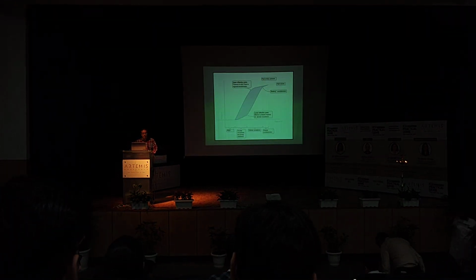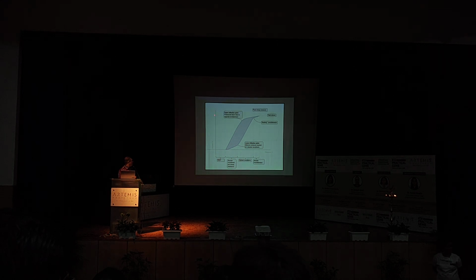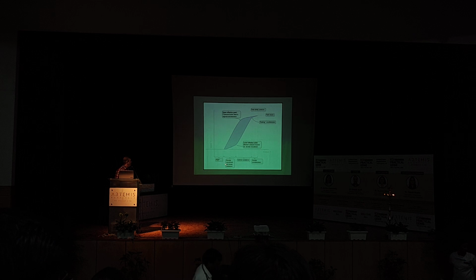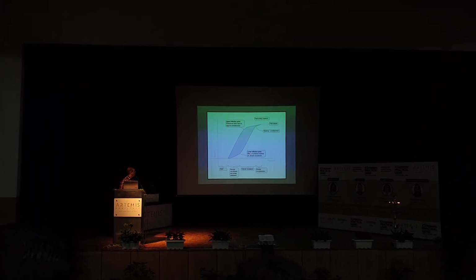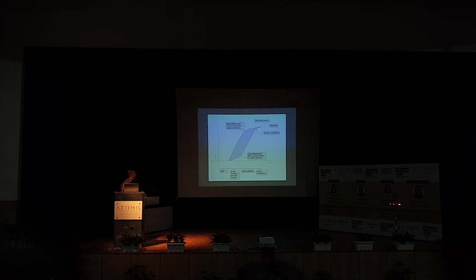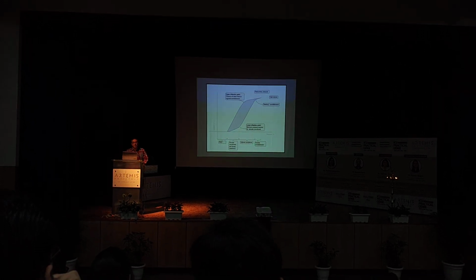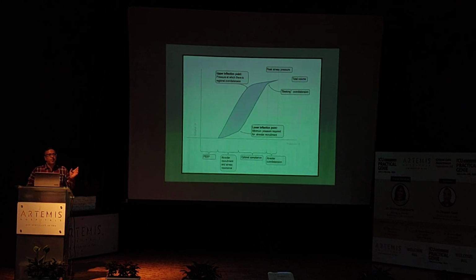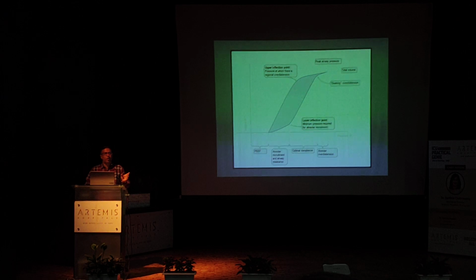So this is how the curve looks when you give a breath. This is the inspiration, this is the peep, this is the volume, and this is the pressure. So this is the peep. Initially, you overcome the air resistance. This is the optimal compliance over the lower inflection point. And then as we reach the higher end, there is alveolar distension. There are newer ventilators which say they can actually calculate the lower inflection point. But remember, there is a space in which the compliance is very good. That is, we need to identify in all of the patients.